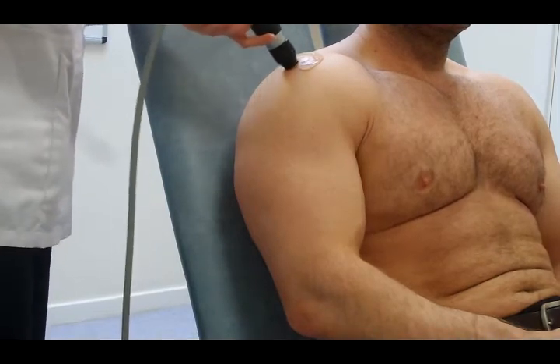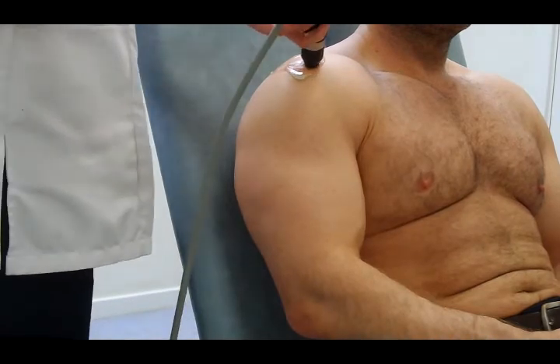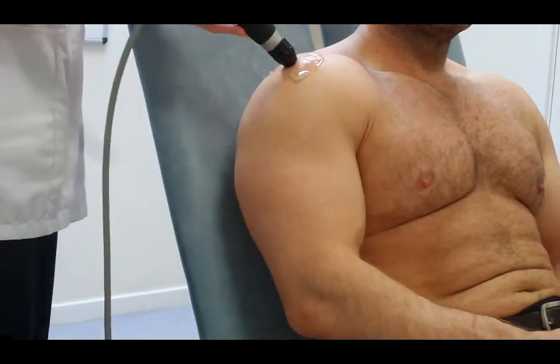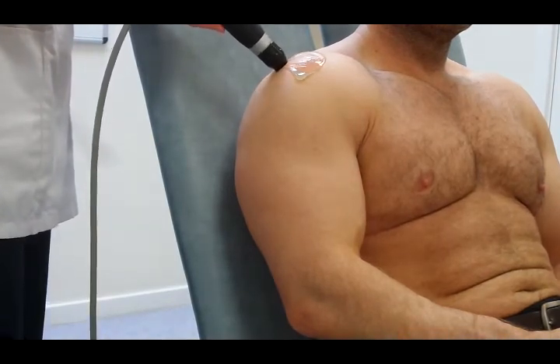We'll bring the gel around the head and around the shoulder and then start the treatment, working from one side of the shoulder to the other.